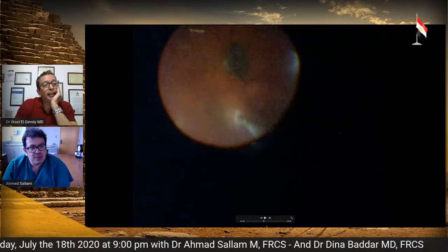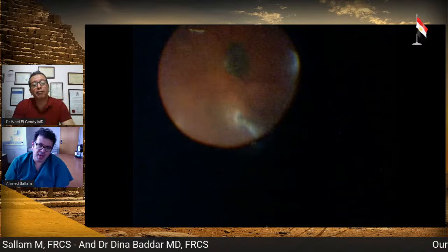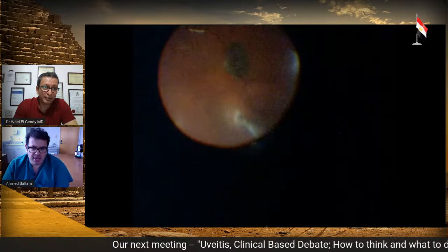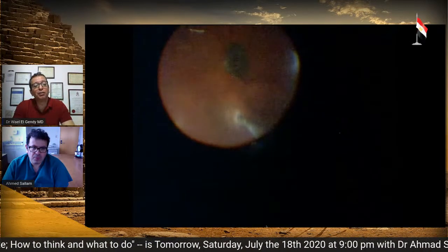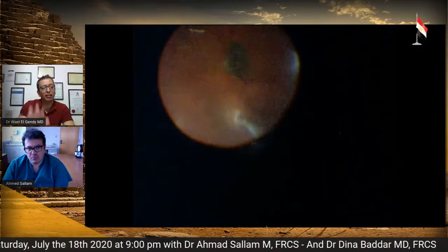Okay. Dr. Ahmed, the tamponade, what do you use for tamponade usually? So I'll tell you what I do. I don't know if you want me to tell you now or after we discuss the active method, as you like. I use PFCL or gas. Oh, sorry, I interrupted you. You were just going to... Okay, let's go back to the active method.